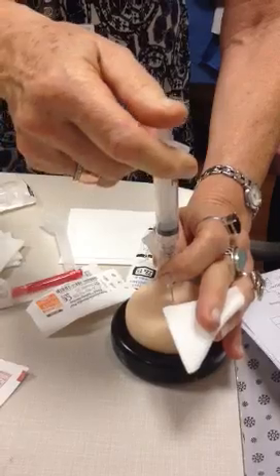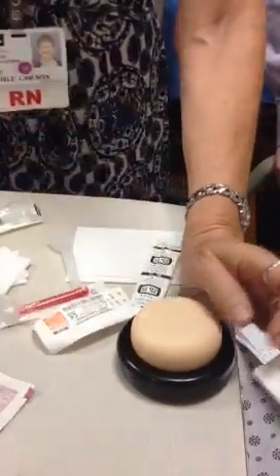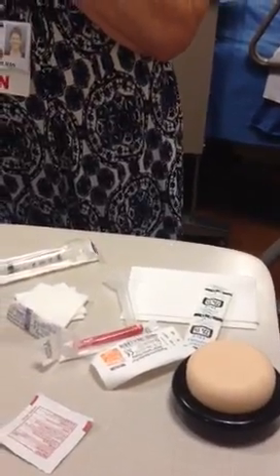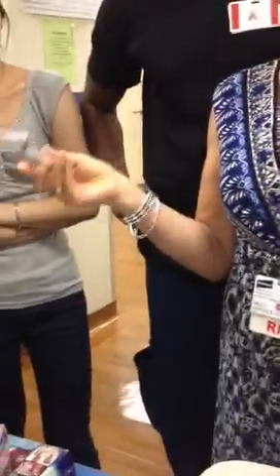How much of the needle should go into the skin? Well, just see how much. You ever put it up to the hub? No. Never, because if it gets broken off, there's no way to get it out. I always go halfway. If it's a very overweight person, an obese person, you would put it in more.